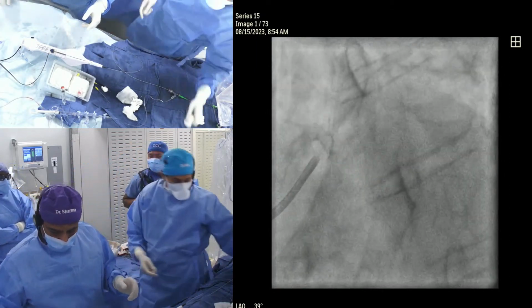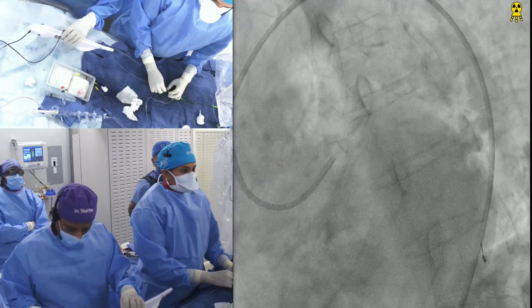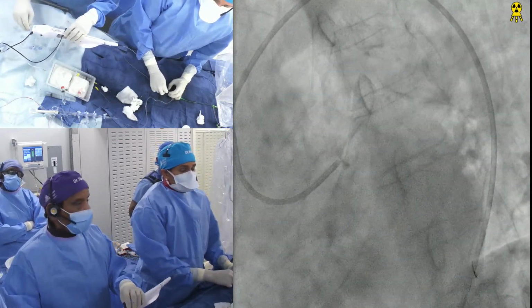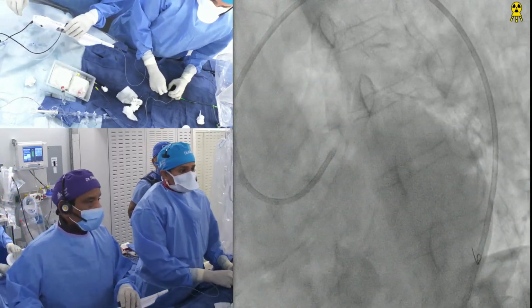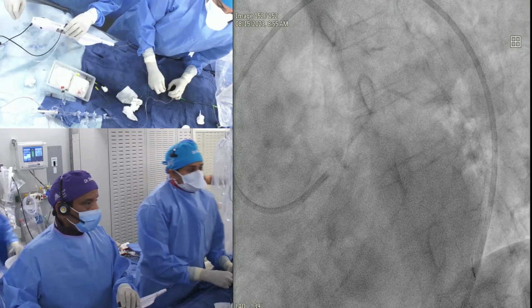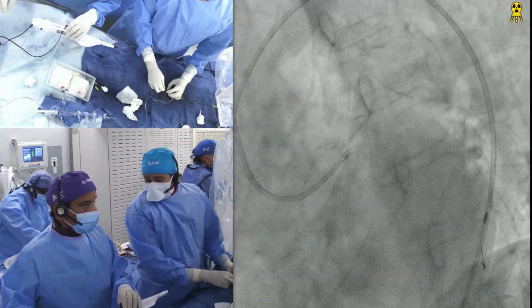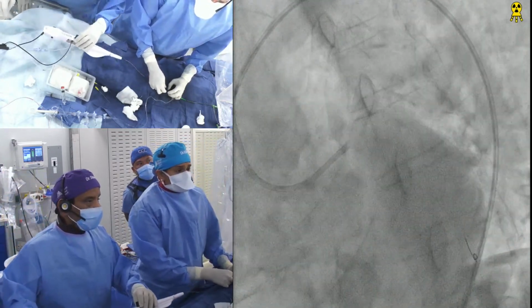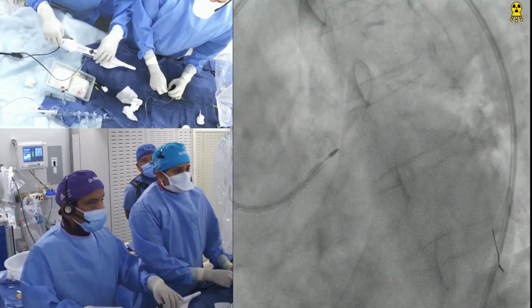Okay, ready. And this is the kind of case where we usually may go with the exchange, so get ready with our Corsair again. You might exchange with it. Usually, otherwise, we go side by side. Okay. Yeah. Make sure your Corsair is ready. Can you go magnified? Okay, guys, go one more magnification. I'm pulling the wire a little more. One second. Good. Don't pull it anymore. Okay, yes. Good.